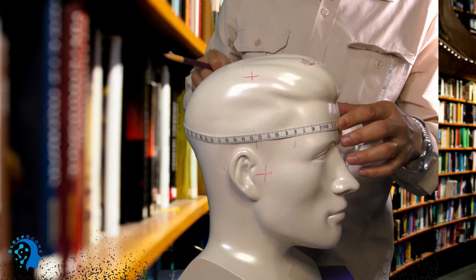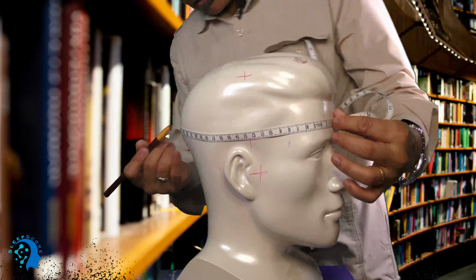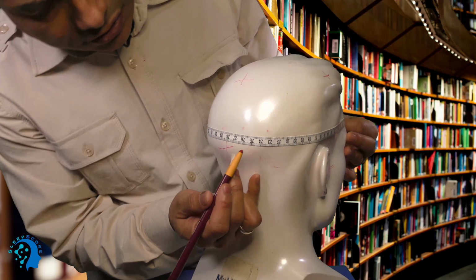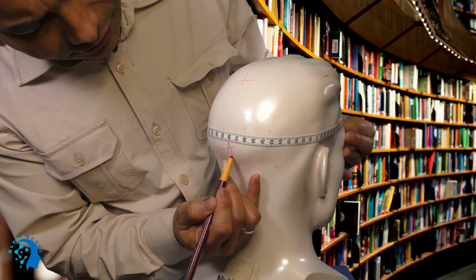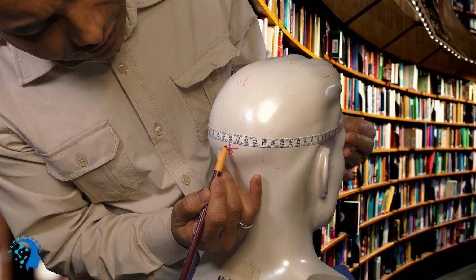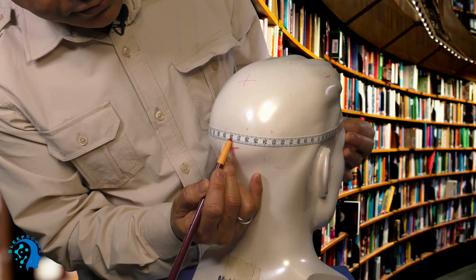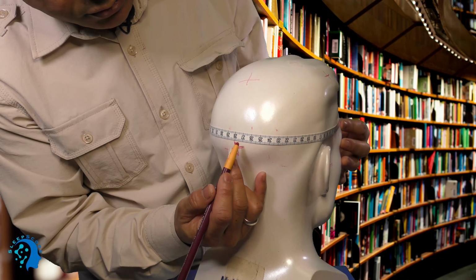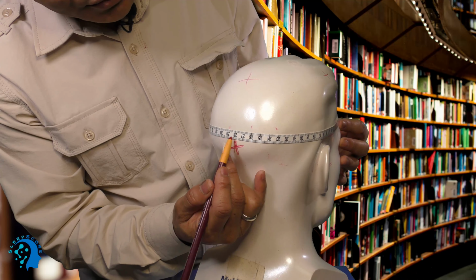So this makes it easier to do like this. So I will take, look at this, which is 28, okay? This is the half. So I cross here, you see? So this is half of 56, which is 28. And normally I have to go 5% on each side, because this distance, we wanted to make it 10%.